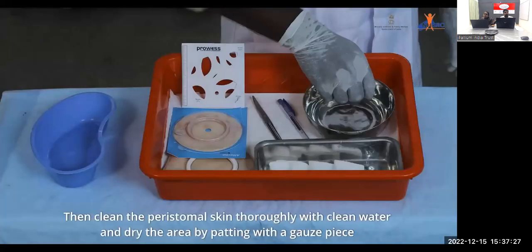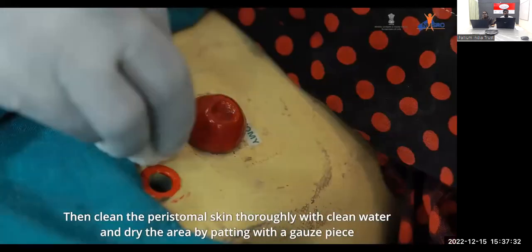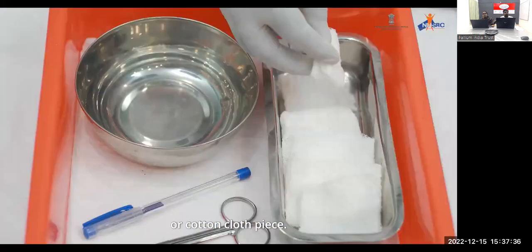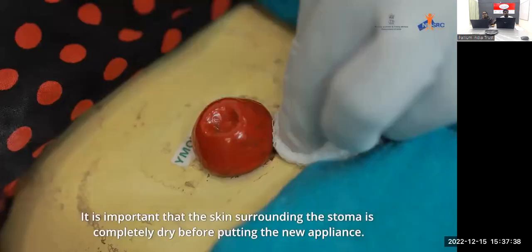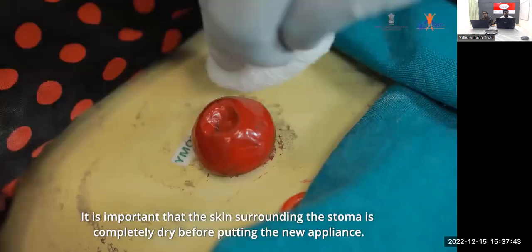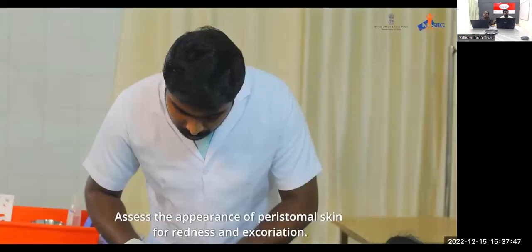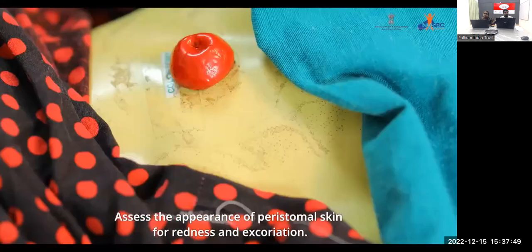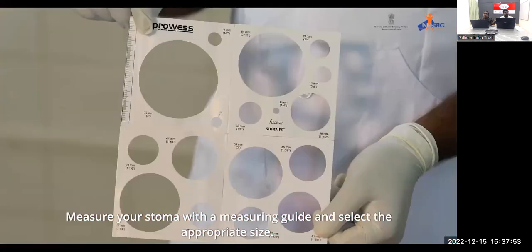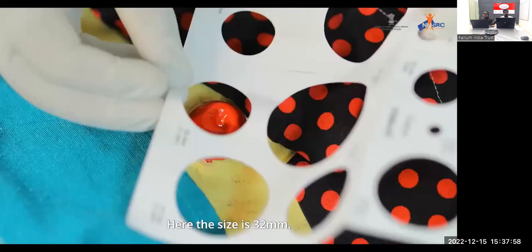Then clean the peristomal skin thoroughly with clean water and dry the area by patting with a gauze piece or cotton cloth piece. It is important that the skin surrounding the stoma is completely dry before putting the new appliance. Assess the appearance of peristomal skin for redness and excoriation. Measure your stoma with a measuring guide and select the appropriate size. Here, the size is 32 millimeters.